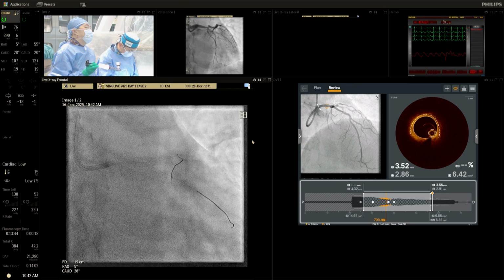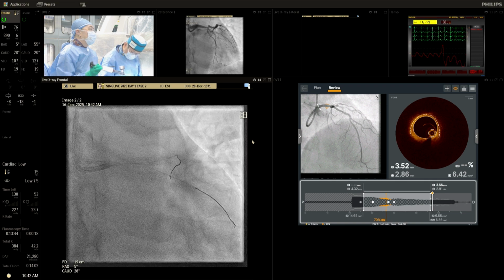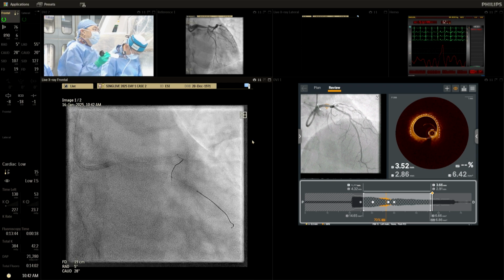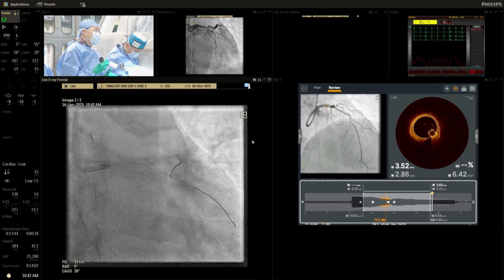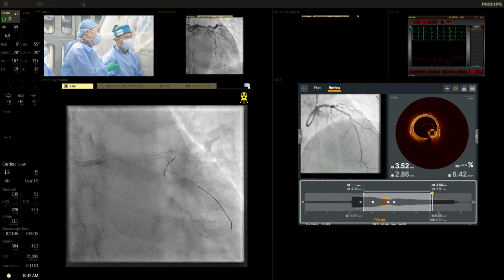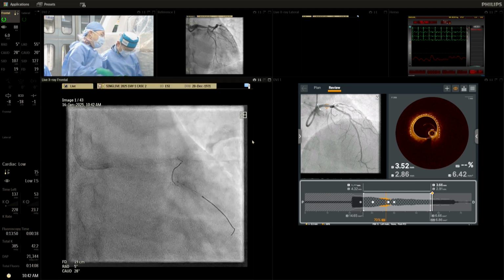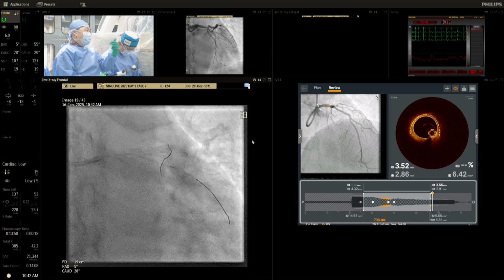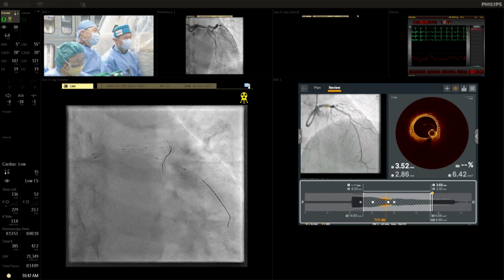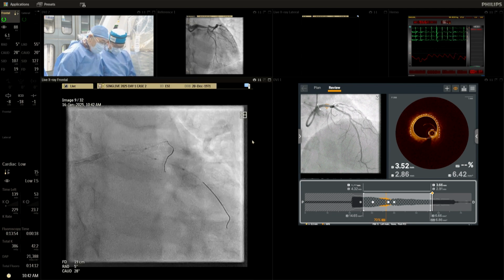Okay, just to answer that, I think this is a 2.0 balloon. A 2.0 balloon usually does not cause a distortion of the opposite side. If you use a very big balloon like 3.0 or 2.5, then the chance of pulling the stent back on the opposite end is high. And secondly, we're going to do a kiss. With a 4.0 balloon in the LAD, it's unlikely that part will be lifted. If you do a final kissing, that should avoid that scenario. Yeah, come, give it a kiss.